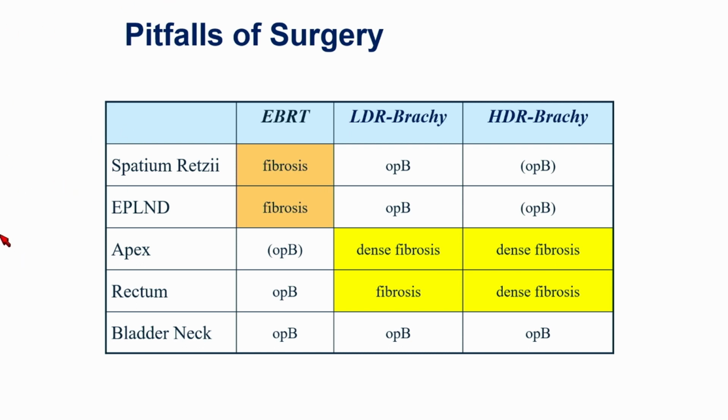So use a PSMA PET scan in locally recurrent prostate cancer to make your decision if this is a patient for radical salvage prostatectomy. And just looking at the cases we have done, I've separated the cases and the difficulties of the surgery depending on the type of radiation therapy which was performed. If the patient only underwent external beam radiation therapy, you will expect fibrosis in the retropubic space, and you will expect fibrosis in the area of your pelvic lymph node dissection.